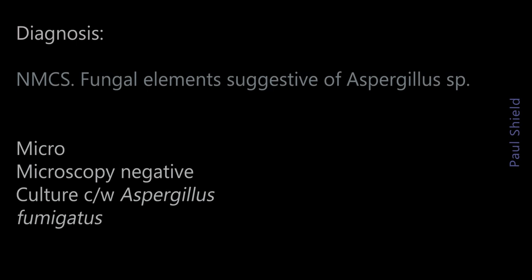This was negative on microbiology microscopy, but confirmed on culture as Aspergillus fumigatus. This patient's history of previous lymphoma, and probably treatment that resulted in immunosuppression, fits with Aspergillus infection.